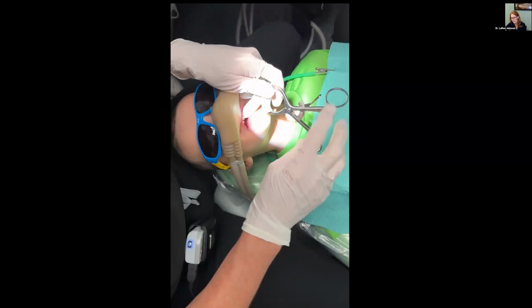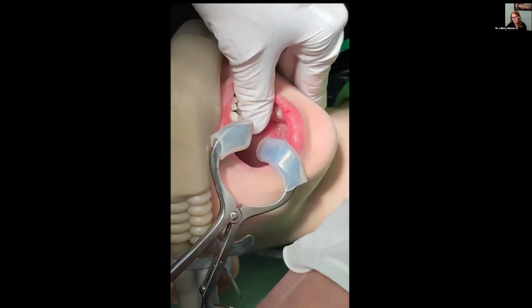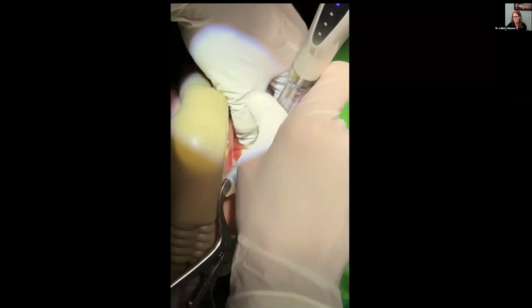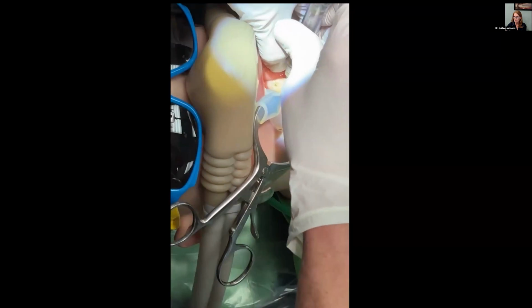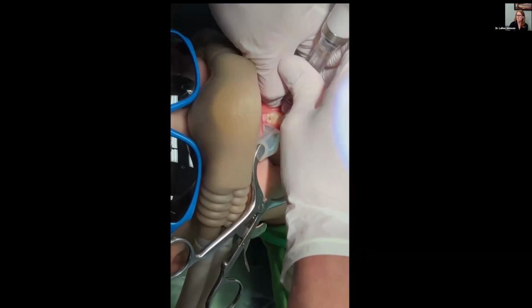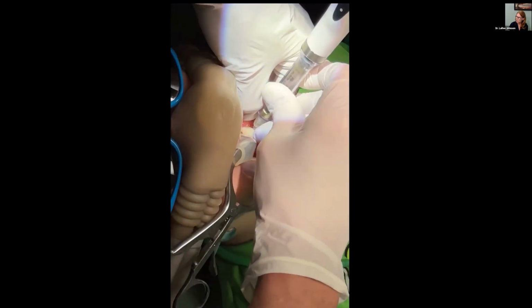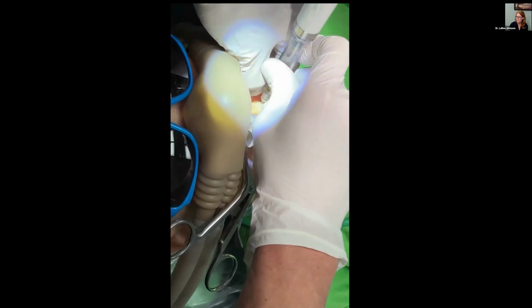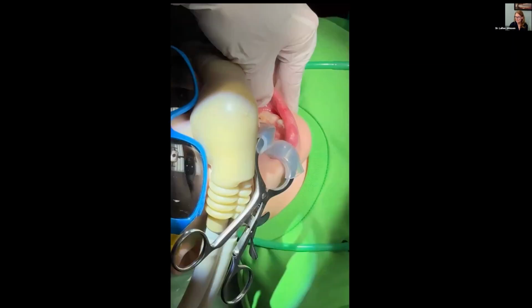This is a little feller. You're going to see this. I like this little case because it's just one of those. You pick it up, you see the caries on that tooth K. You come in, you do your blanching, you come out and then pop through. And I will let you know, the further you get back, the angle gets trickier, especially if you're working on a second permanent molar, especially when you use nitrous, because that nitrous nose gets in your way just a little bit. So be cognizant of your angle.